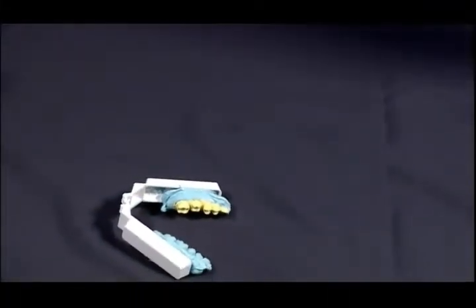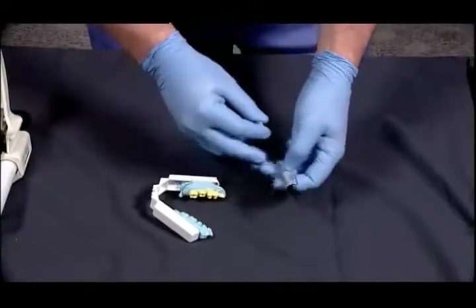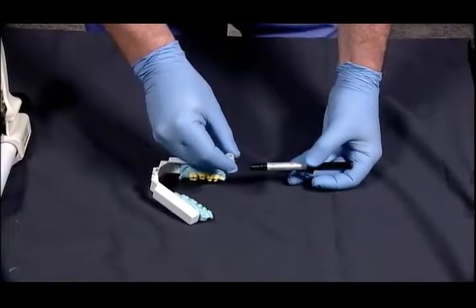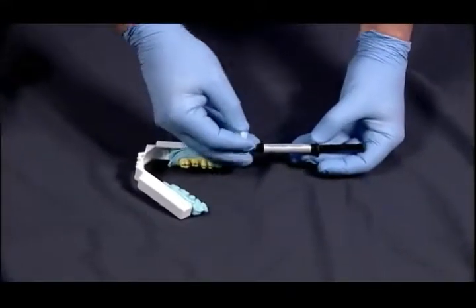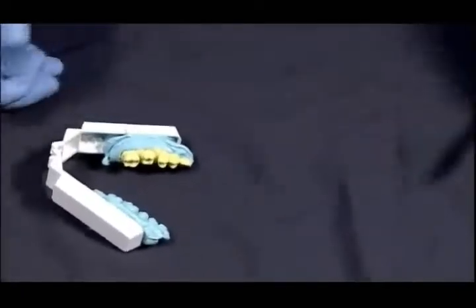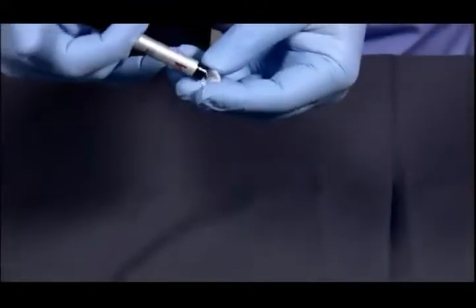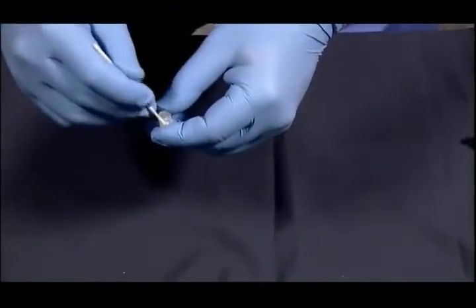Once it's been roughened up, you are going to be adding a surface activating material that is dedicated to this particular heat pressure cured nano hybrid composite, and this material is called Composive, and it comes from Kerr. It will be coming with the direct crown kit so that you will be able to add composite to it. So the first thing that you'll do is add just a small amount of the composite to the inside of the crown. Then we'll paint it on all surfaces of the tooth.